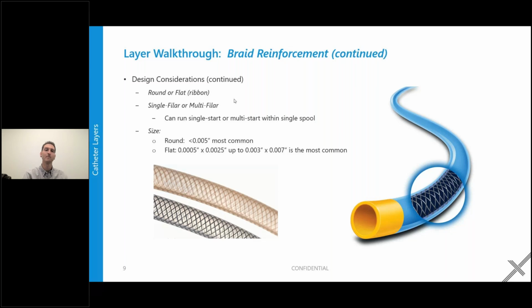For ribbon wires, the smallest one that is typically used is half thou, again, 0.0005 by 2.5 thou. You can also get half by 3. Then you have 1 by 3, 1 by 5, 2 by 5, 2 by 6. And generally speaking, one of the biggest ones you're going to use is 3 by 7. There are bigger wires. I have used bigger wires, very uncommon for very specific applications. But this is kind of the range that's most common.